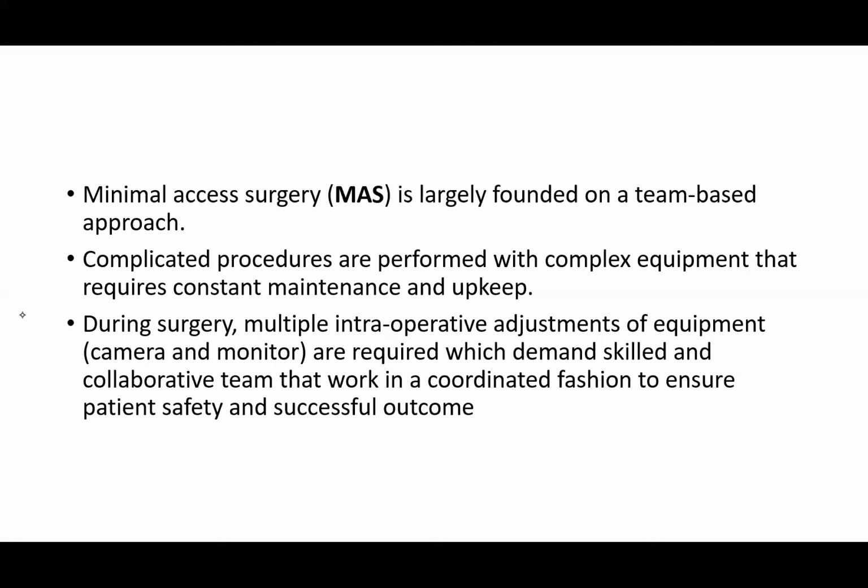During surgery, multiple intraoperative adjustments of equipment, the camera and monitor, are required, which demand a skilled and collaborative team that works in a coordinated fashion to ensure patient safety and successful outcome.